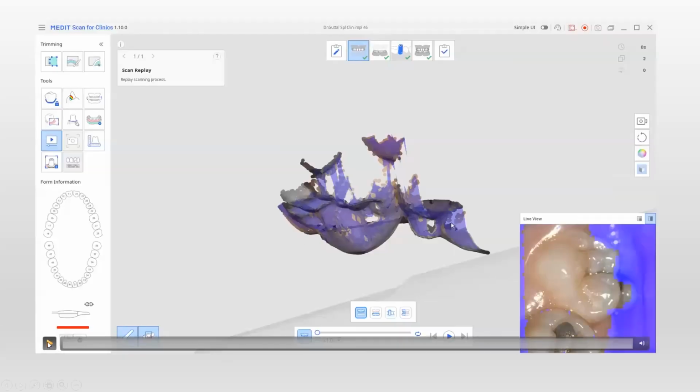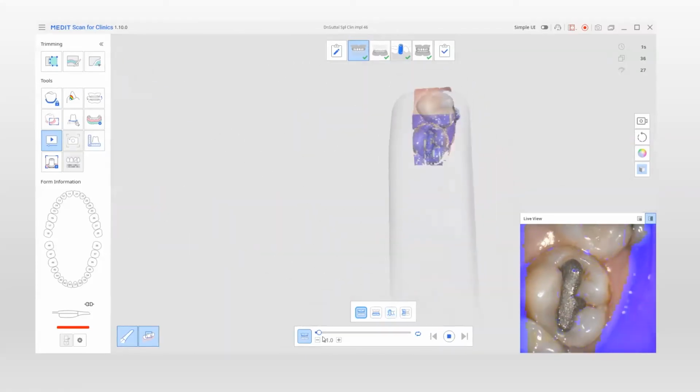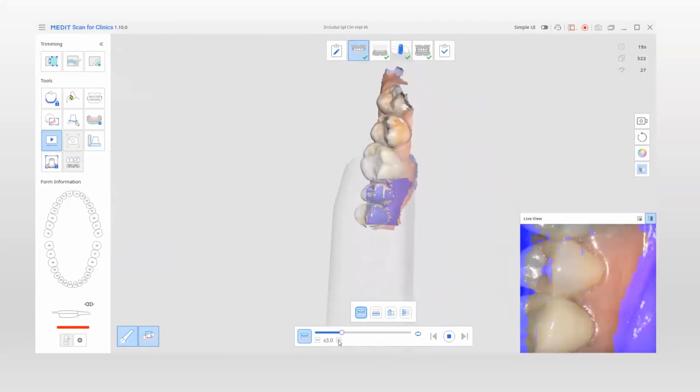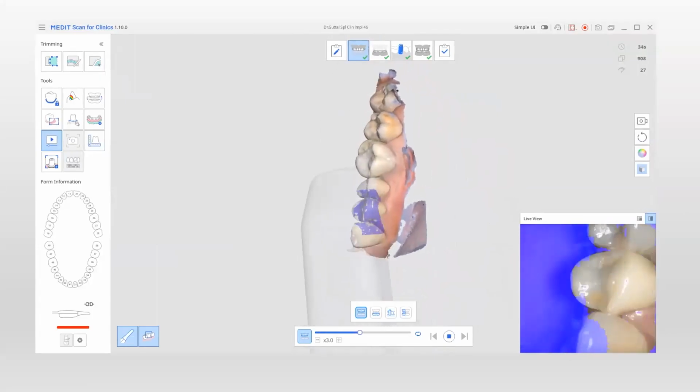We can see the scanning here of an implant. The case we did now, planning done for the 4-6. This is the opposing arch, upper arch scanning. We need not do the entire arch, full arch scanning, since it's a single tooth implant.